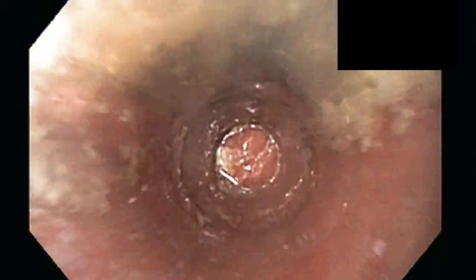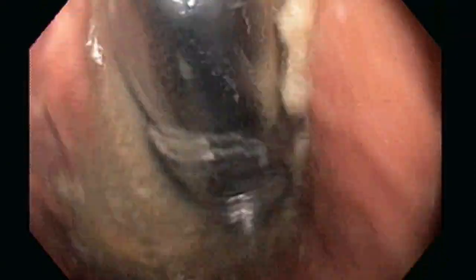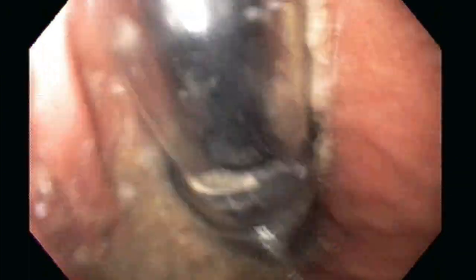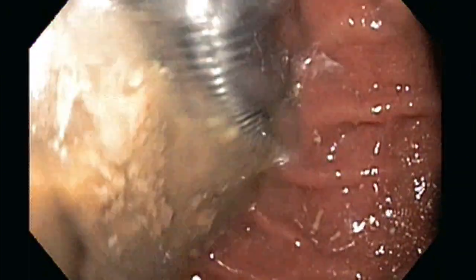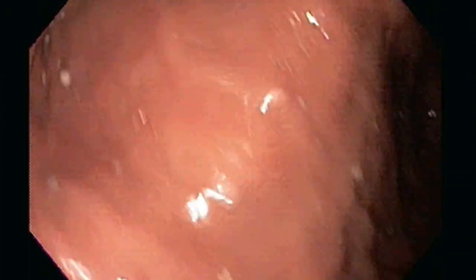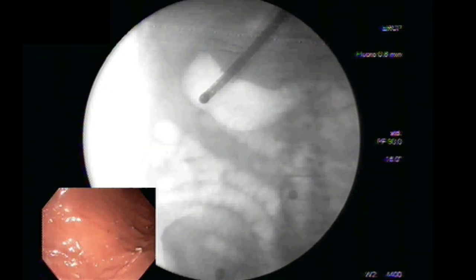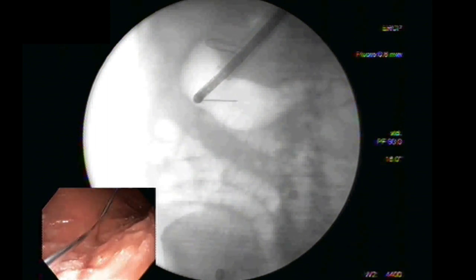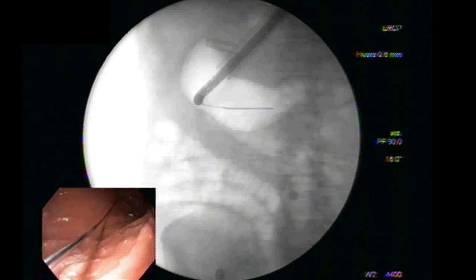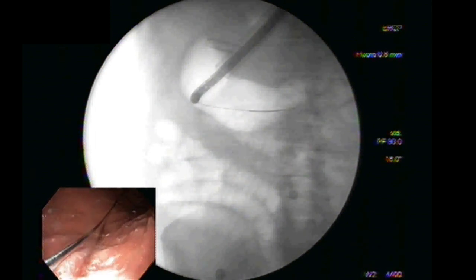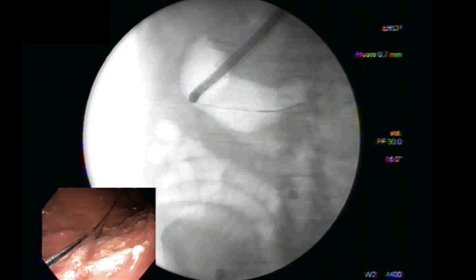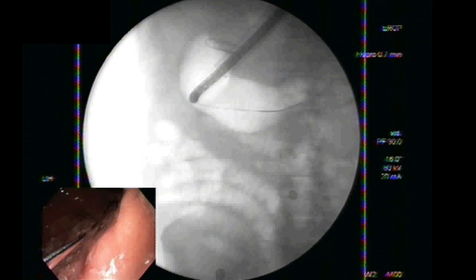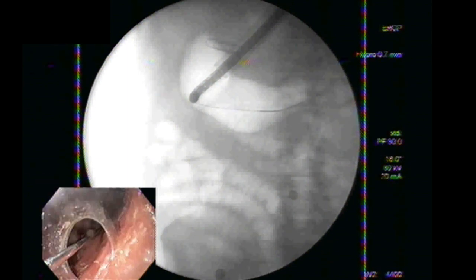The correct positioning of the overtube is confirmed under direct endoscopic visualization. A guide wire is passed into the stomach. The location of the gastroesophageal junction is marked externally using paper clips, and the scope is withdrawn.